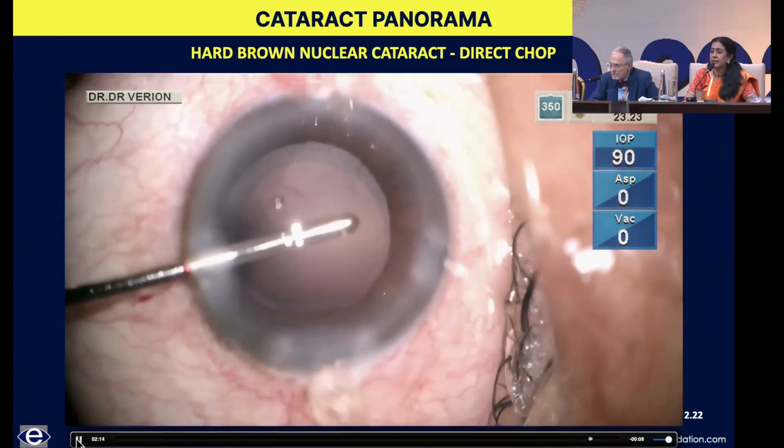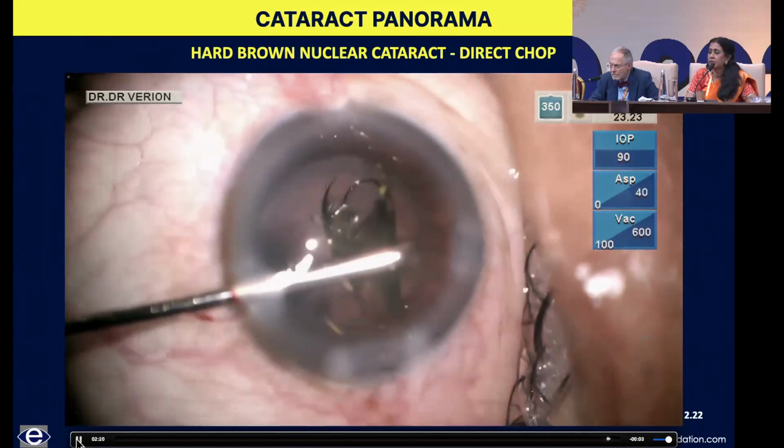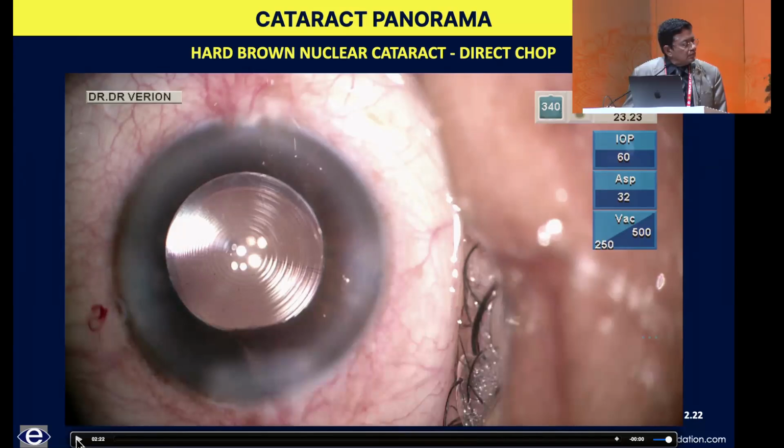All right. I don't have a lot of experience with that, but you just have a tight incision, and then you're using the spatula to keep things from bouncing up. And I think if the incision's tight, you just have to be ready to put it in, because sometimes you're going to engage the capsule, there's a leak or something like that. I think there are a lot of Indian surgeons shifting on to the hydro implantation, and it works quite well.